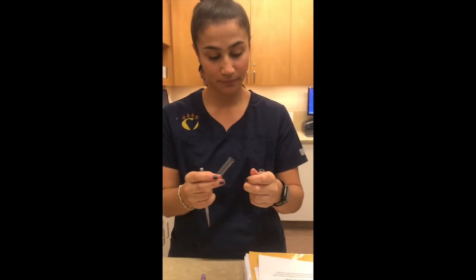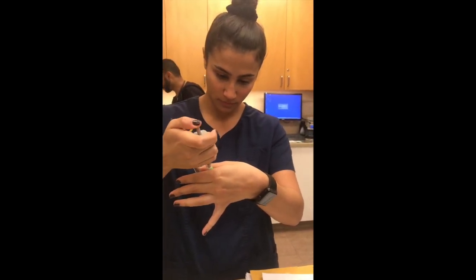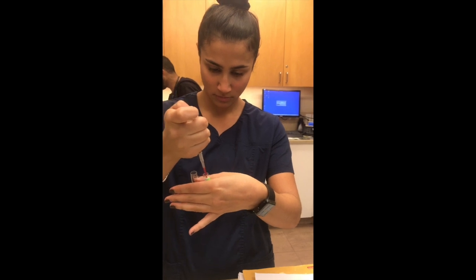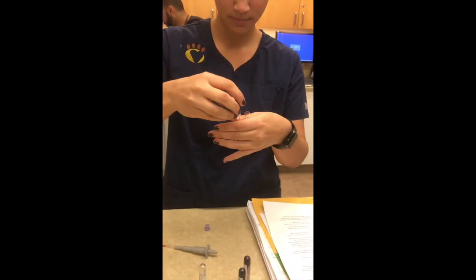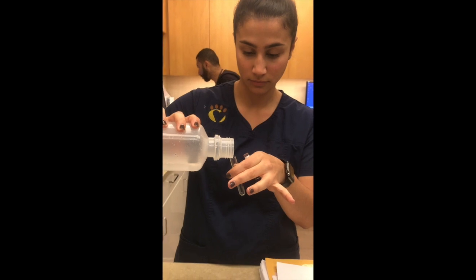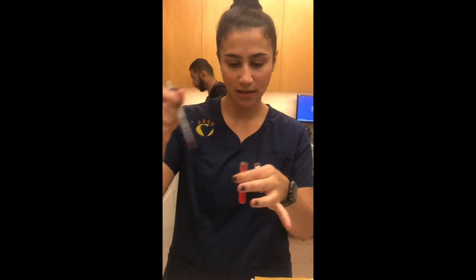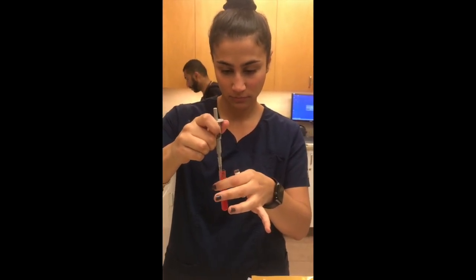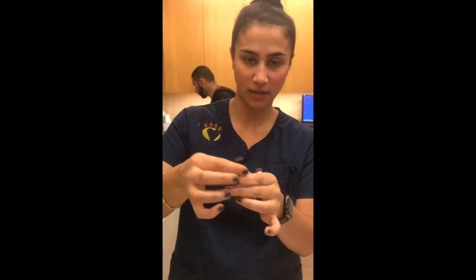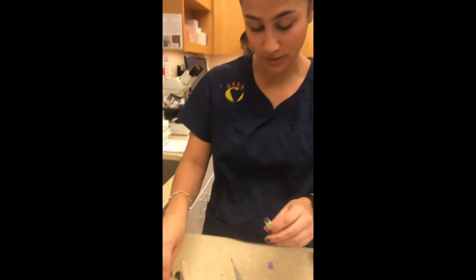Now first with our donor, I'm going to take 2 drops of blood and put it into our glass tube. Perfect. And now I'm going to fill it with saline. Now I'm just going to gently mix it. Great. There we go. Now we have our donor. So that will stay right there. And now I'll do the same thing with our recipient.